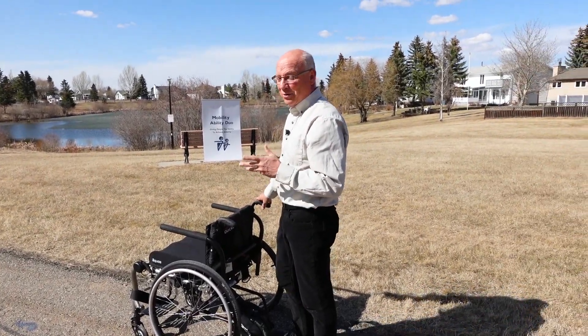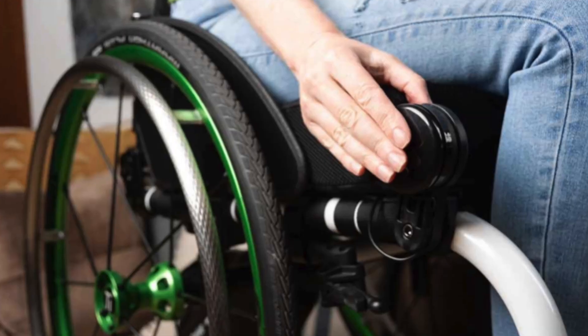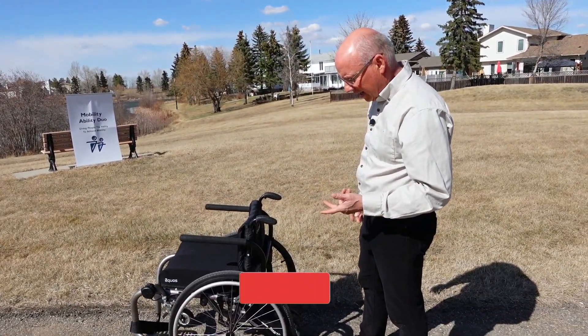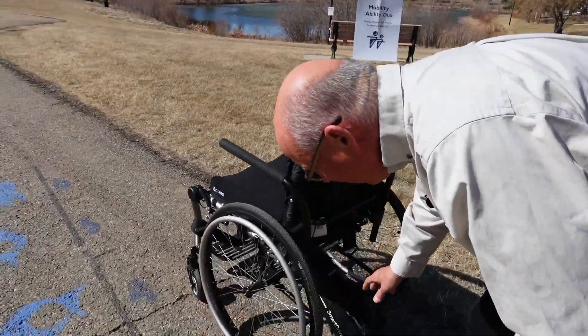Hey Bills. Hi. So today we're talking about power add-on units on chairs. It looks so cool. It's really nice. It's a TiLite, so we really like these chairs a lot. We also brought what's called a SmartDrive. Let's take a look at this thing.